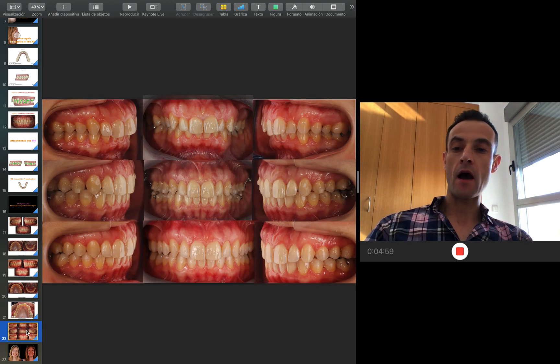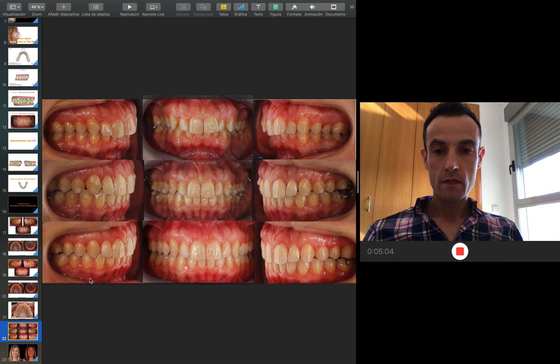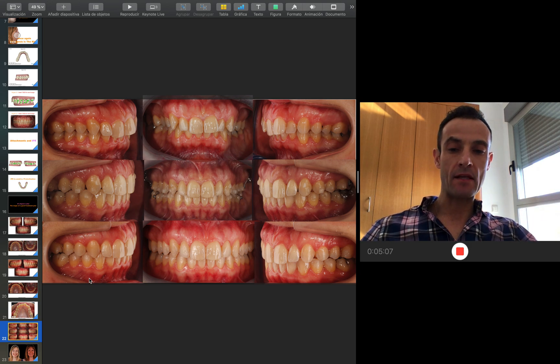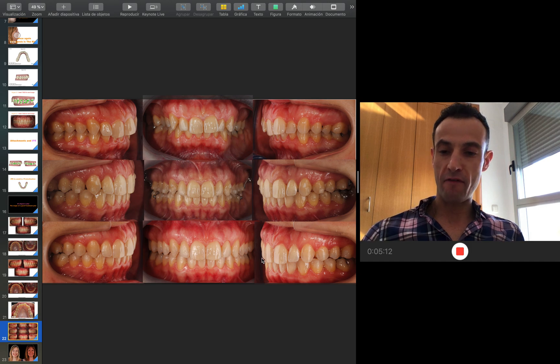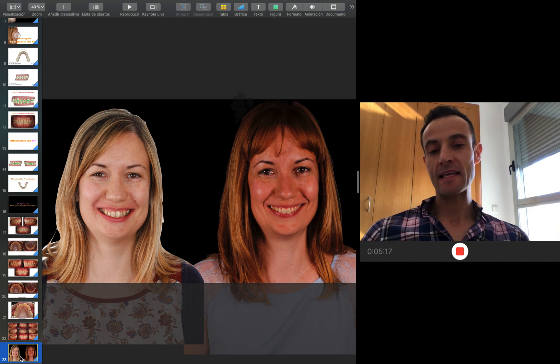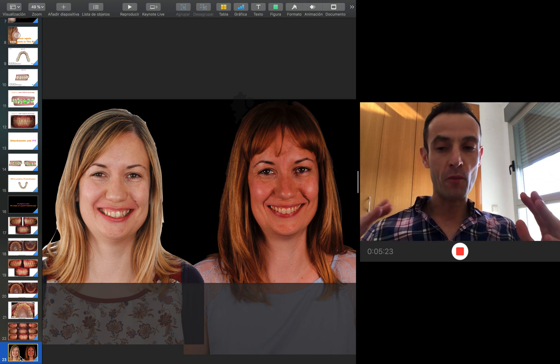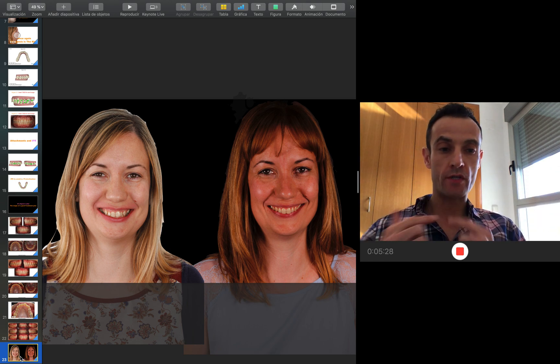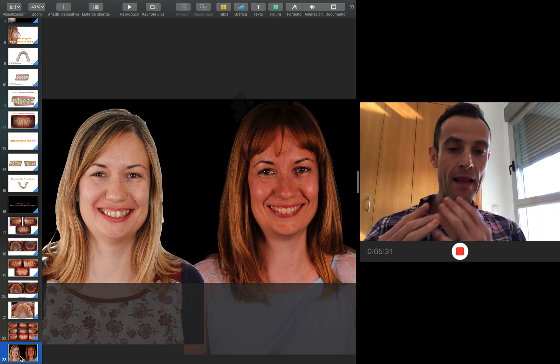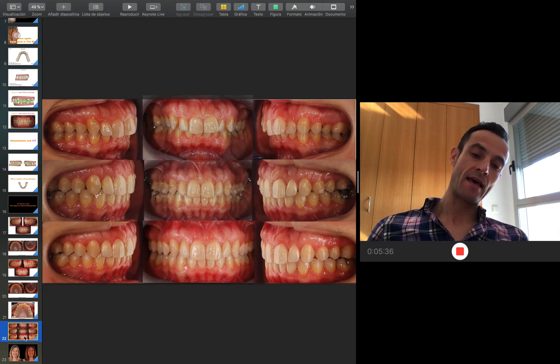Here you can see how we start with the bilateral Class 2, deep bite, and canted occlusal plane — in the middle of treatment with the screws, and then at the end with everything clean and the final occlusion in Class 1. The aesthetic change is amazing. Working with this philosophy, I can achieve a wider arch, a full mouth smile. I will do intrusions and retrusions so I reduce the gummy smile in the front, better balance with the lips — and as you can see, the evolution is amazing.